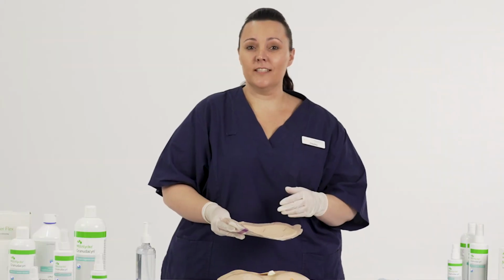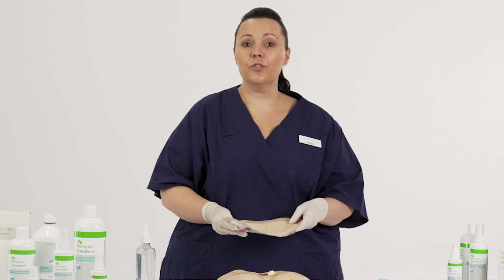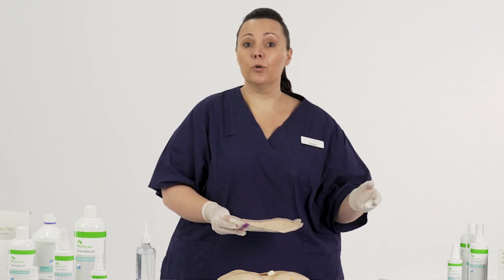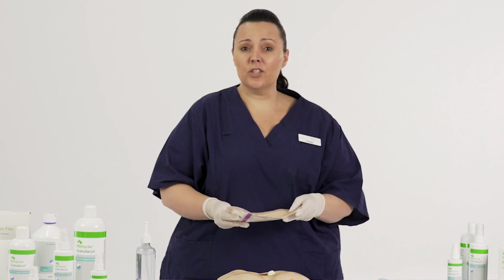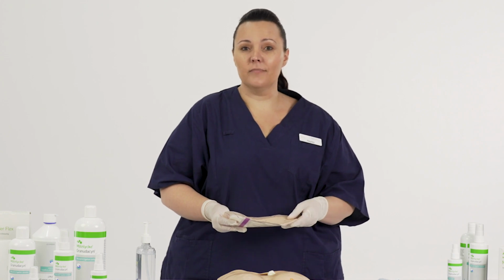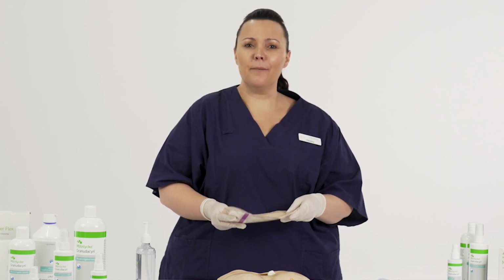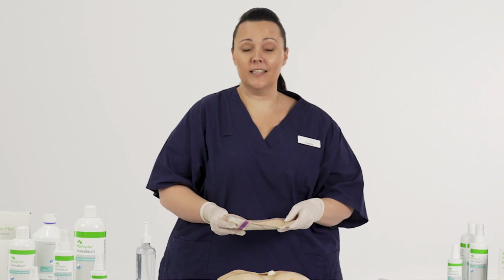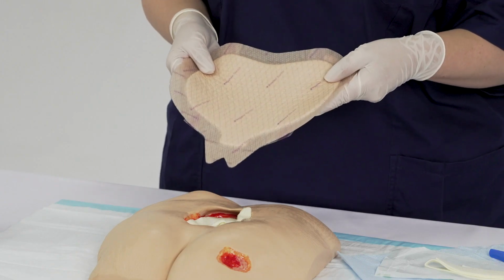When choosing the dressing to cover the wound, it is important to choose a dressing that minimises pain upon application and removal. Effectively absorbing exudate is very important, and you need to consider the comfort for the patient. And how long is the wear time? Up to 7 days is wonderful because it provides undisturbed wound healing. Today I'm using Mepilex Border Sacrum.